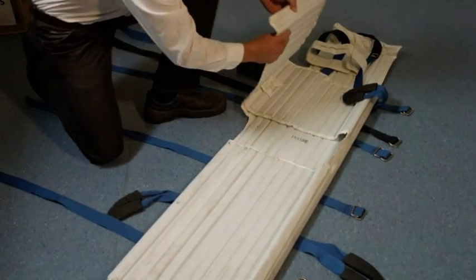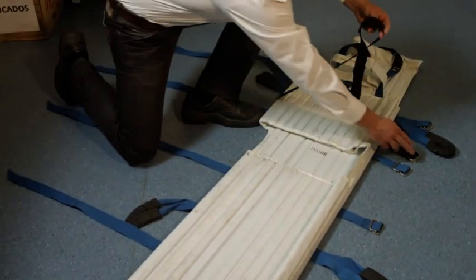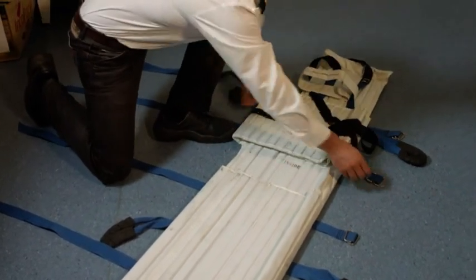Whenever there is a serious injury on a vessel, the initial recovery of a casualty will be done with the stretcher on board. Although there are various types available, this will typically be a Neil Robertson stretcher. Made of bamboo slats and covered with canvas, it has a series of straps and buckles that secure the casualty, and it forms a cylindrical shape when fastened.